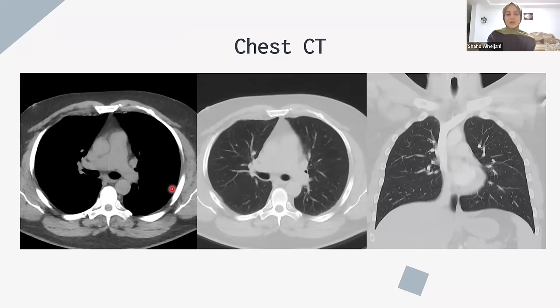So this can't be the lung window. So if there is any abnormality in the, yes, exactly, mediastinal window. So here you can see the mediastinum. If there's any abnormality in the aorta, in the vessels, and anything in the heart, you will be able to tell because you focused on those. But in the lung window, you will be able to see the specifics of the lung.